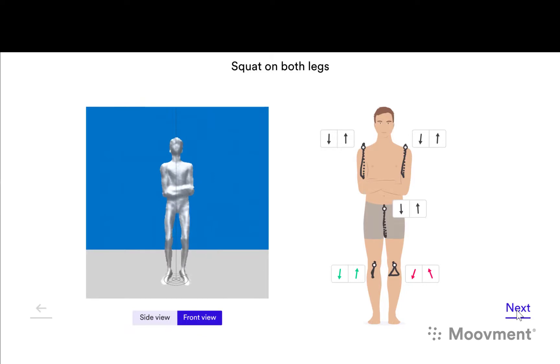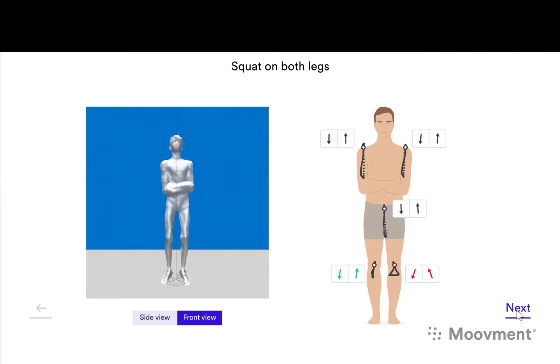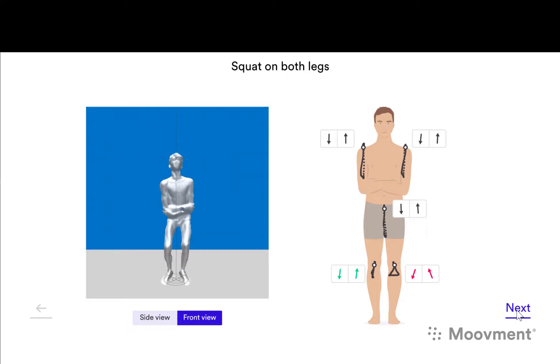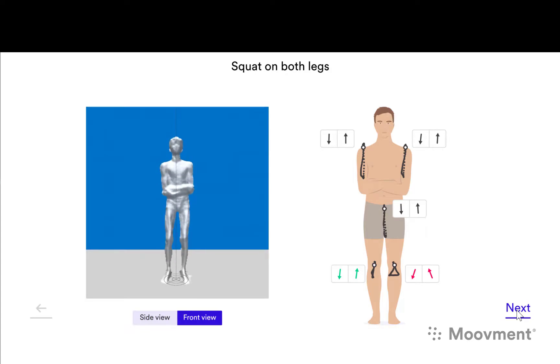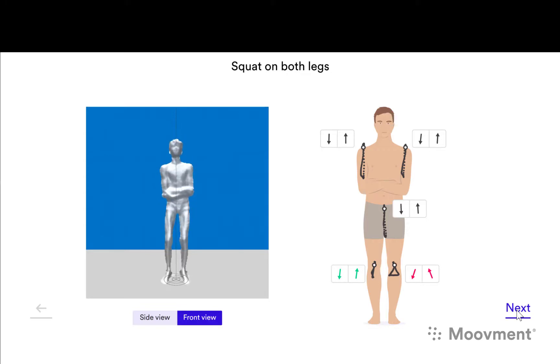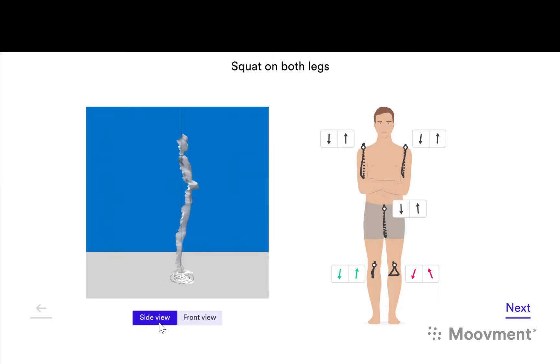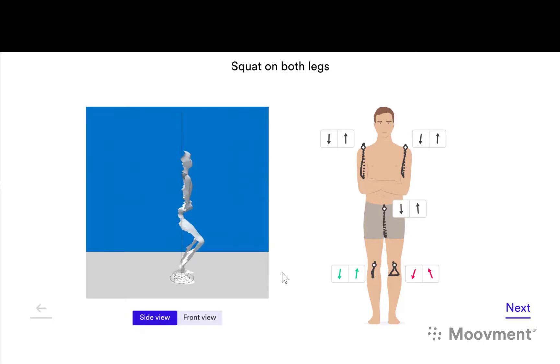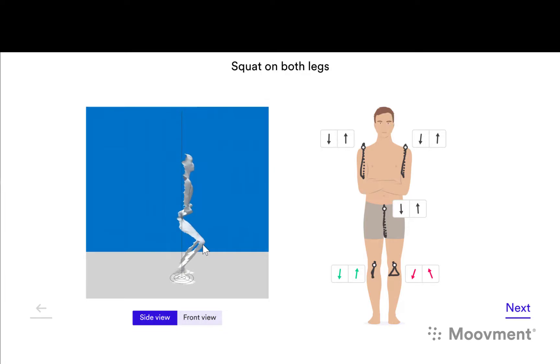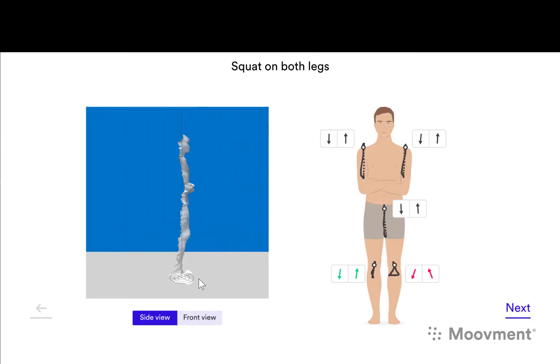It's when we look at the double leg squat or dynamic balance that things go a little bit off center. In this case pretty much everything is off center, and we can track it from the top of the squat to the bottom of the squat and then the return to the top again. If you want to review this inside to see if he leans forwards or leans backwards, if in fact he's got a restricted squat or a free squat—in this case his knees go well and truly over his toes, so it is not a restricted squat.